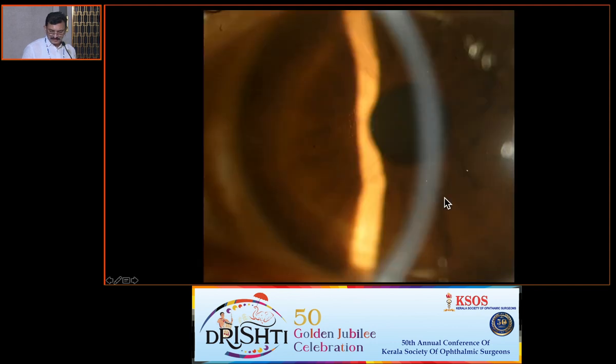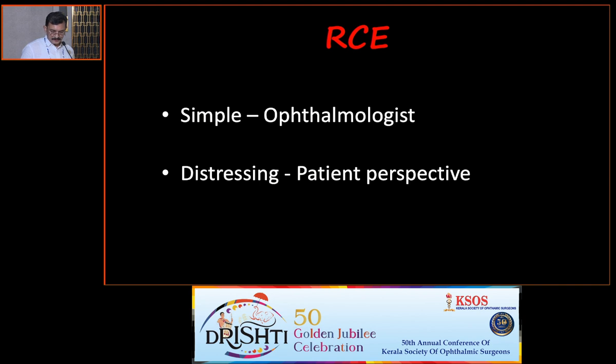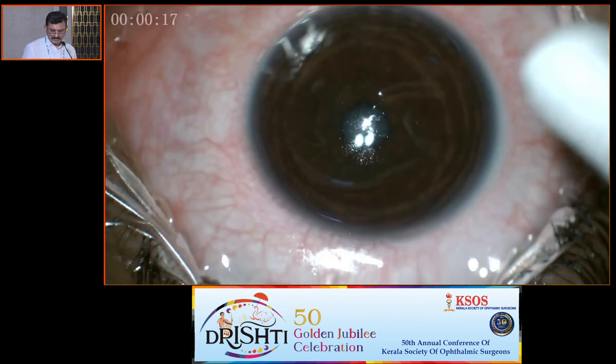Then RCE, this is a beautiful one. You need to recognize where the RCE is, seen on slit lamp examination. And OCT, they say you can see RCE, but we find it very difficult to see. So on slit lamp examination, you can see where the RCE is. It's a very simple thing for ophthalmologists, but very distressing from the patient's point of view.